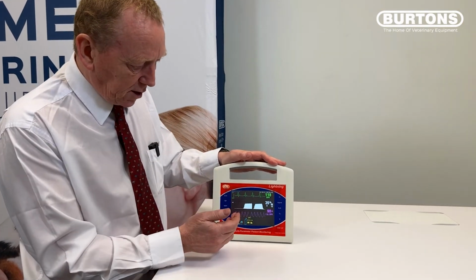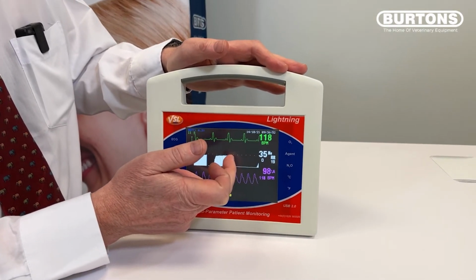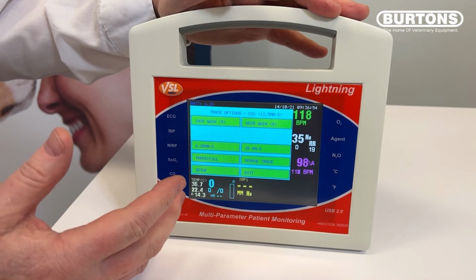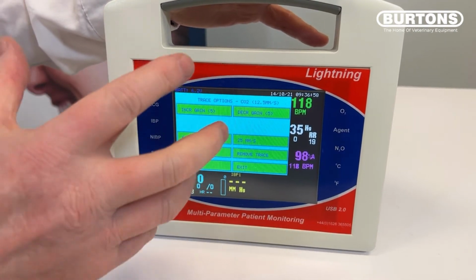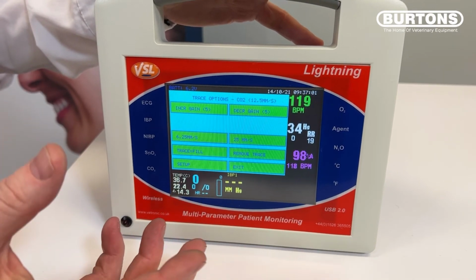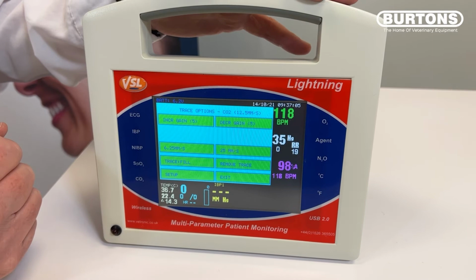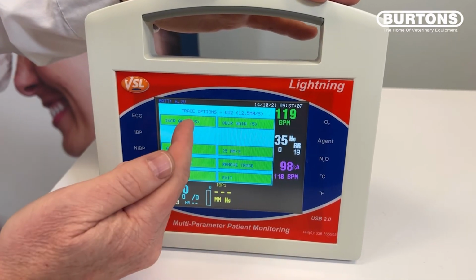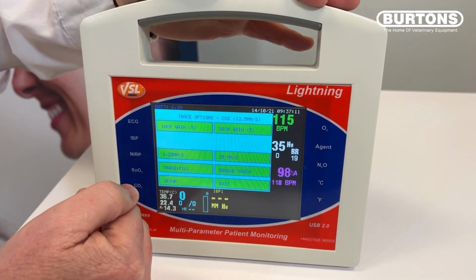So to start with, if I touch any of the trace areas, such as the centre of the screen on the CO2 trace, it pops up a little menu and we can see that this says trace options, CO2. And we now have the option to change any of the features associated with the trace of that part that we've just touched. So here, for example, we can increase or decrease the gain of the CO2 waveform. We can change the speed at which it goes across the screen.